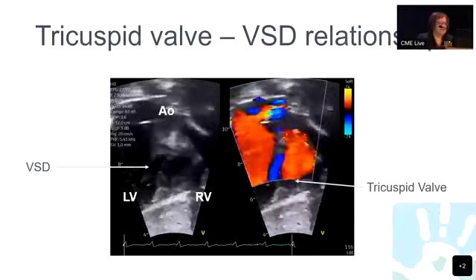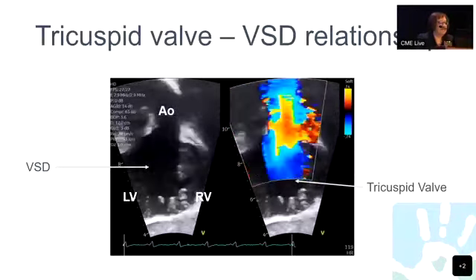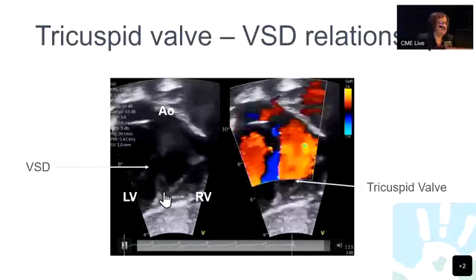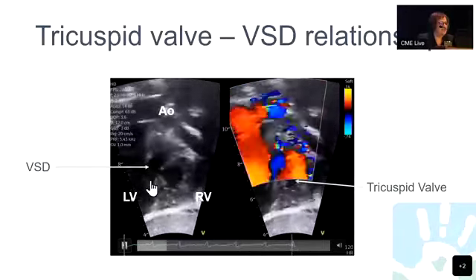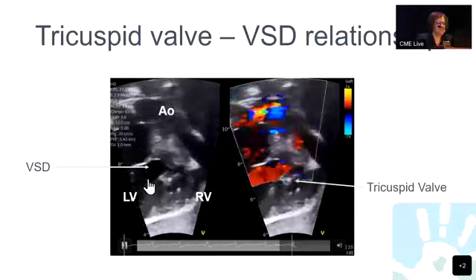So here's an image right here where we do see a tricuspid valve right here that's in close proximity and has attachments right to the crest of the septum.